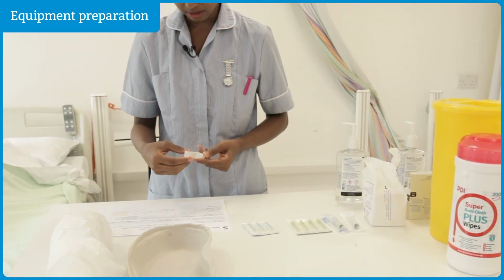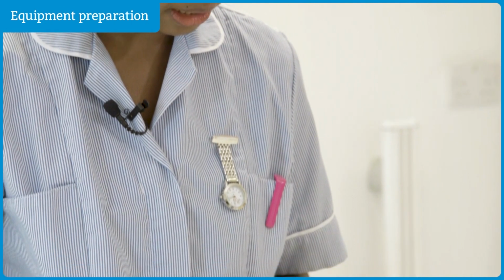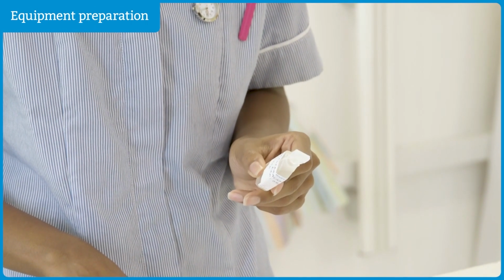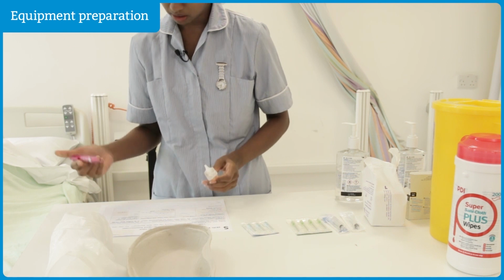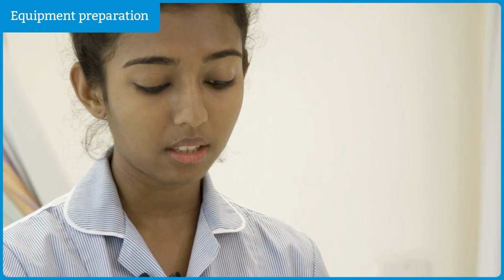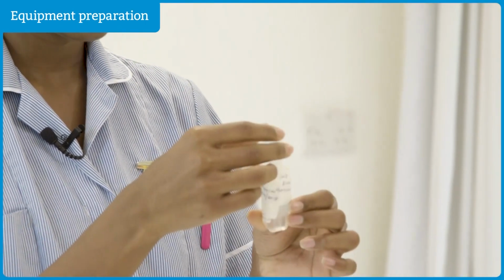So it is injection hydroxycobalamin, 1 milligram per ml injection to be given by intramuscular route. Its expiry is on 8th of 2018 and the batch number is 12345. So I need to write down the batch number and it is 12345. Check the ampule is intact with no leaks. I'll check whether the ampule is intact and it's not leaking or anything.